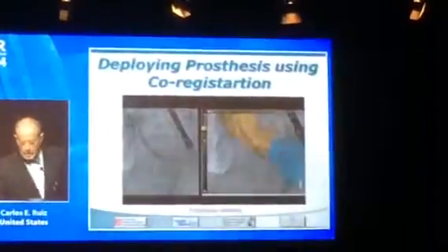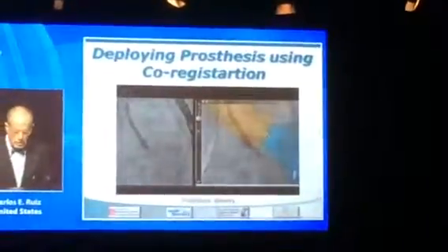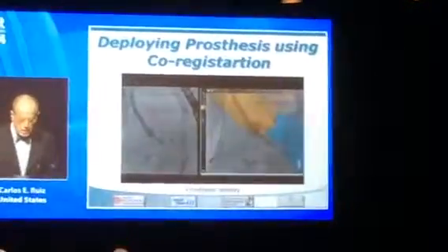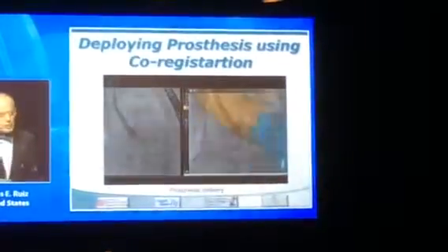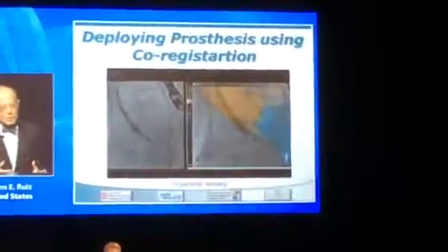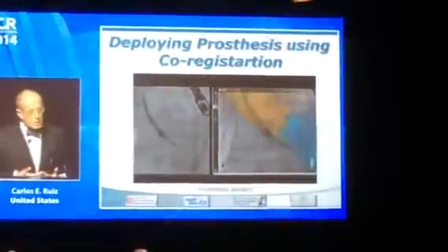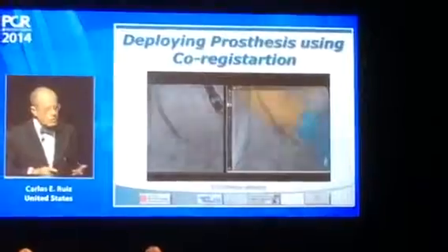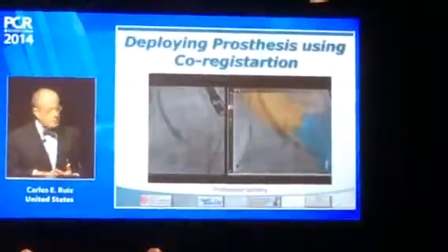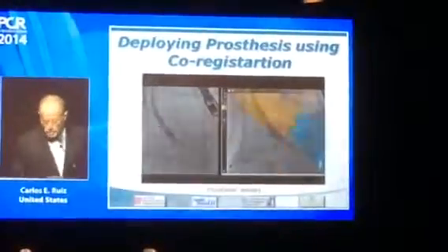Now you can see that the circle has been converted into a single line where all three dots that you were seeing before are aligned. That's where we want to start deploying the valve. You see the difference because one is in real-time fluoroscopy and the other is the pre-acquired image — there is definitely a difference, as it is a single-plane, single-phase representation of the fusion versus real-time.